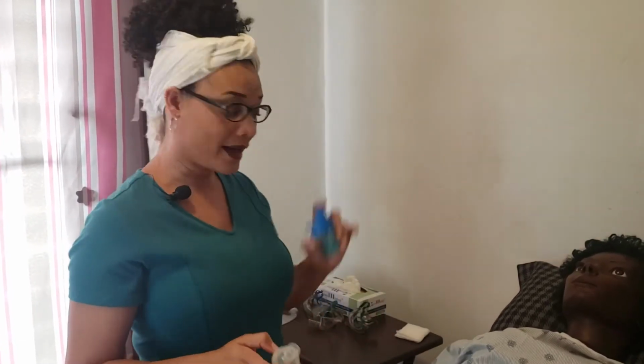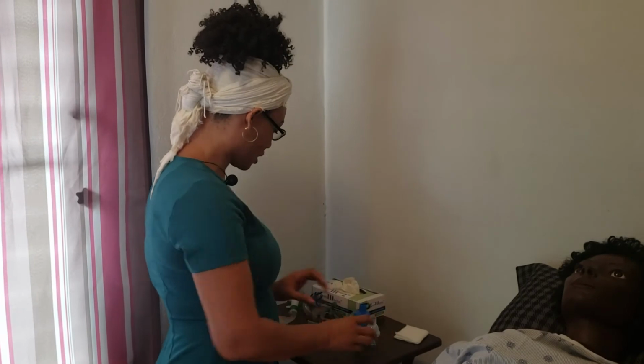Usually when you attach these to oxygen tanks, it has to be at a very high flow. It has to be like 10 or 15, just in order to get it bubbling. That's why we normally use a machine that is specific for that purpose, that pushes enough air. But don't be surprised if you are ordered to give medication by your oxygen tank as well.